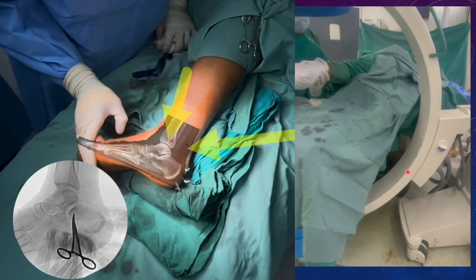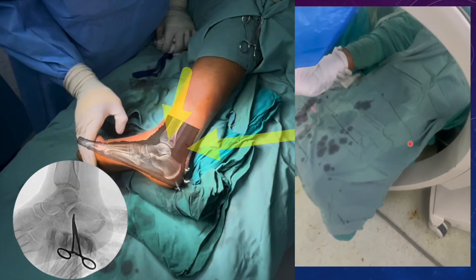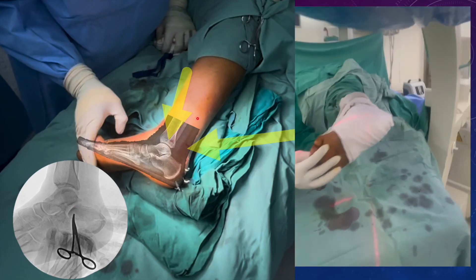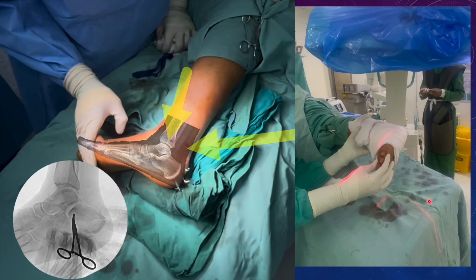Now you see in this video, we have placed the C-arm console at an angle to the table. We are getting a good lateral view without any difficulty. You can see the positioning of the C-arm is clear of any hindrance on the foot end of the table. Now we'll be getting the axial view.